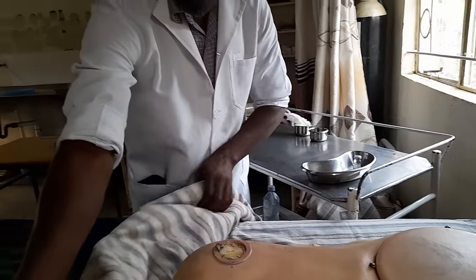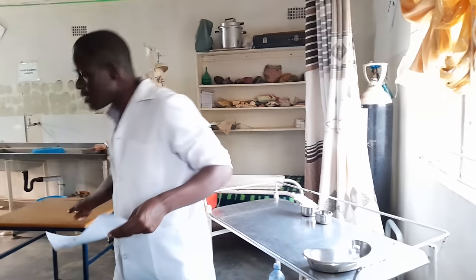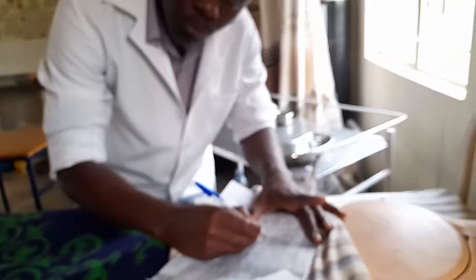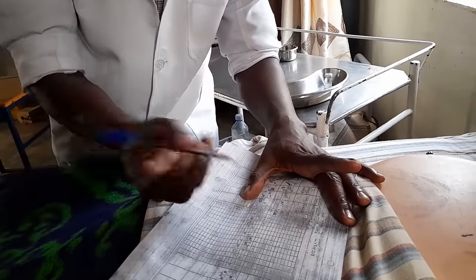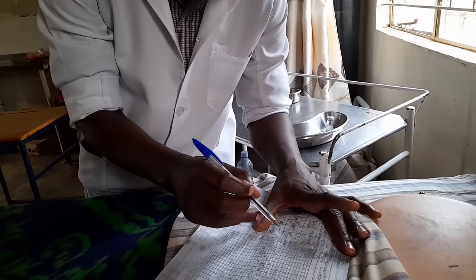Go to the patient and thank them: 'Thank you very much, Mr. Luwoya, for allowing me to do the procedure. I'm doing this so that you get better fast — medication will help you recover quickly.' Then get your biro and sign the drug chart. Since this is the 18-hours dose, sign in that column with your initials to indicate that medication has been given.